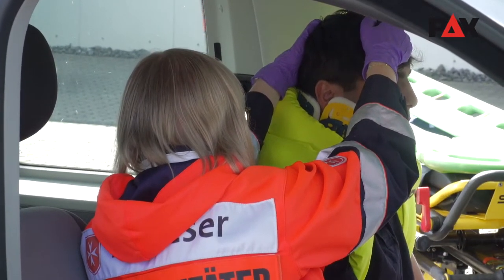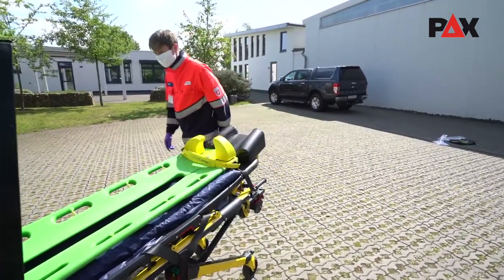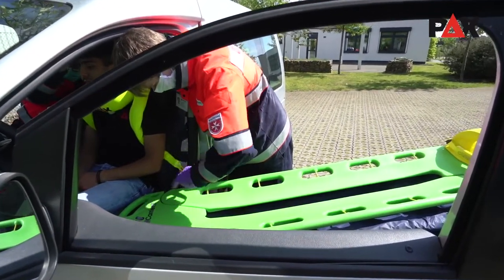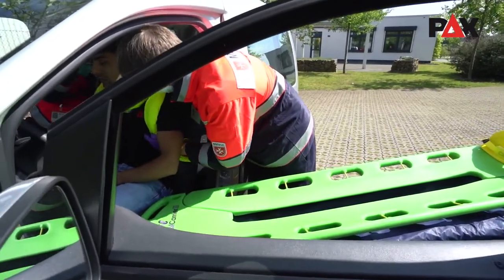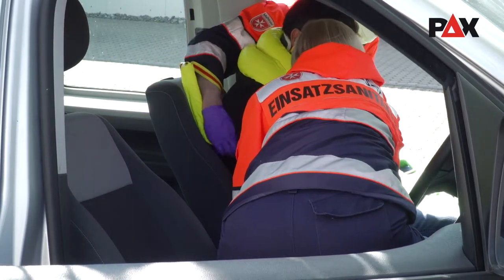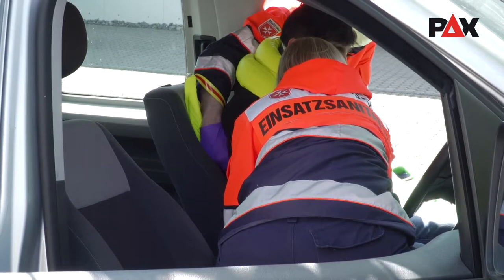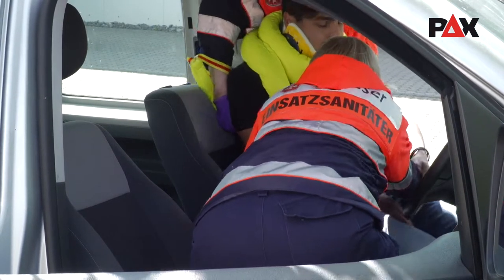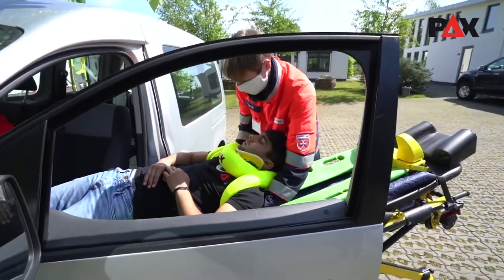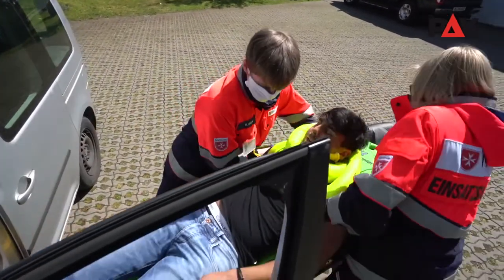After the carriage has been positioned on the vehicle with a spine board and set at the height of the seat, the first helper reaches through a loop of the BOA and pulls it under traction. Only then can the second helper release the head and take the patient's pelvis laterally to support the rotation. Tension, rotation, and positioning of the patient are a fluent continuous movement. Because this vehicle has relatively high seats, the second helper must assist in pulling the patient into the final position.